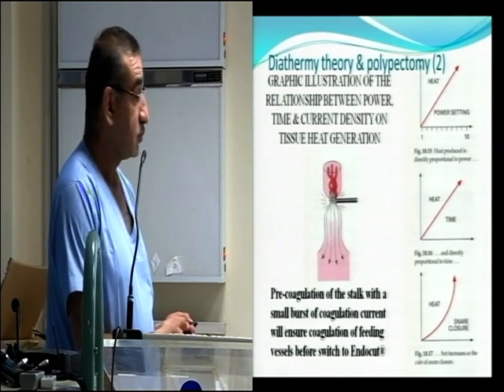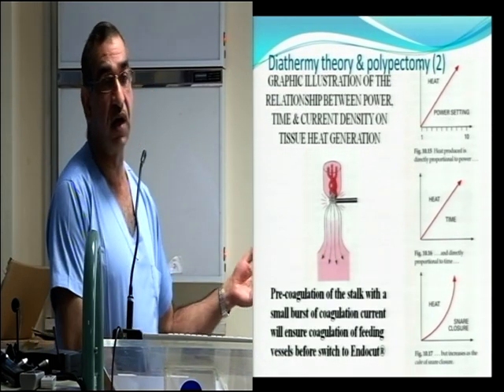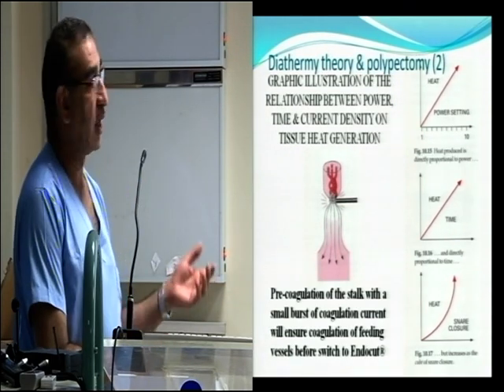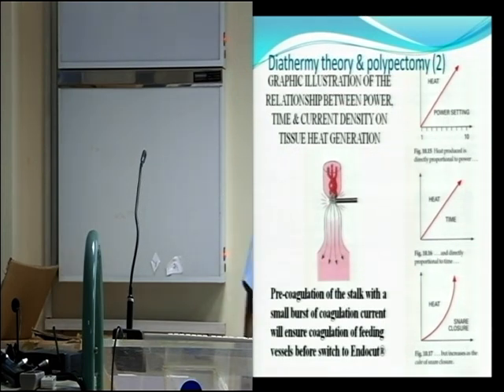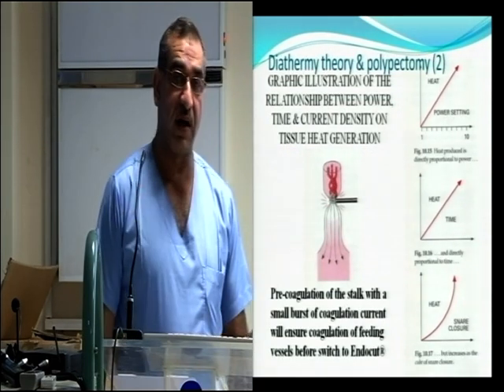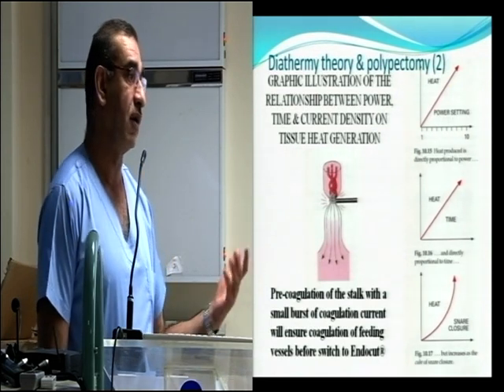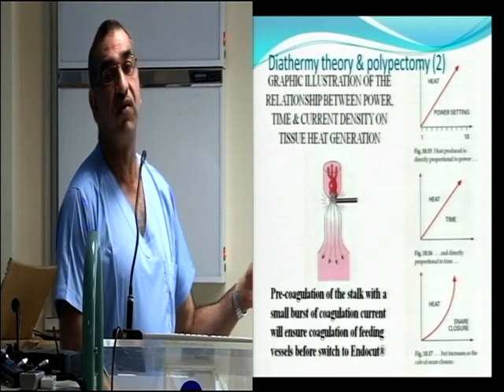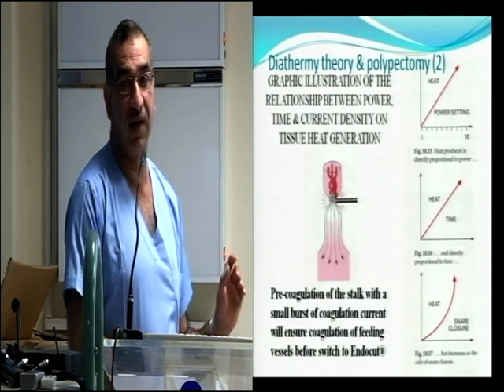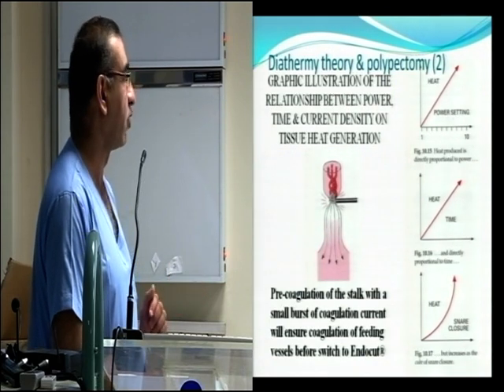Sometimes, if it's a big polyp, we put an endoloop snare around at the base of it, and then you put your snare above the endoloop. The only problem I have with that is that we use that very infrequently, and sometimes if I've got a nurse who's not familiar with it, they mess it up because it's quite fiddly, and it might make things more difficult for you. So I've stopped doing that.